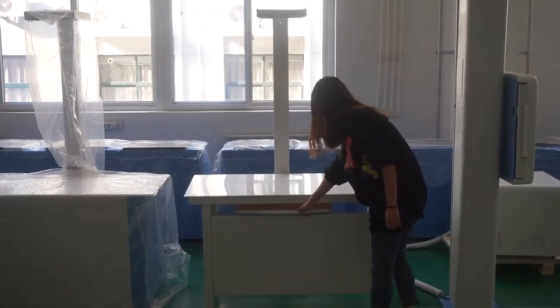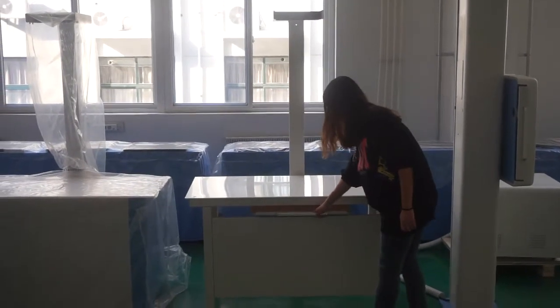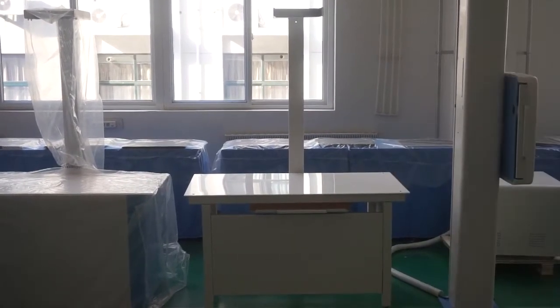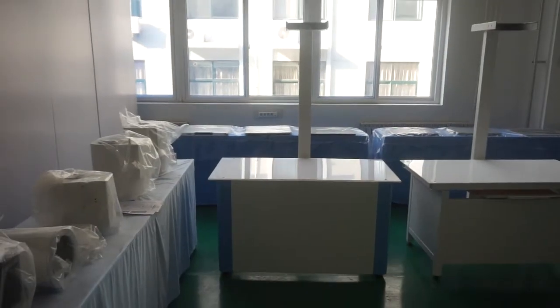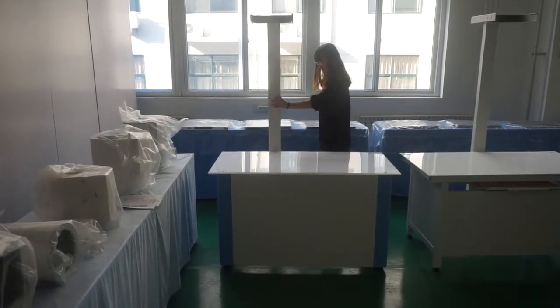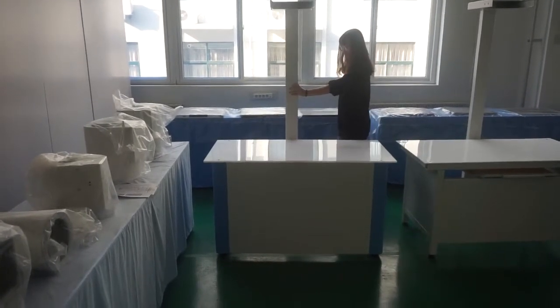Newheak's simple vet bed with bucket can hold cassettes, CR IP boards, and DR flat panel detectors. The size of the bucket can also be modified according to the size of the detector used by customers. It can hold 14x17 and 17x17 detectors. The bed surface cannot be moved, but the bucket can move according to the positional difference of the film, which can better locate an image.